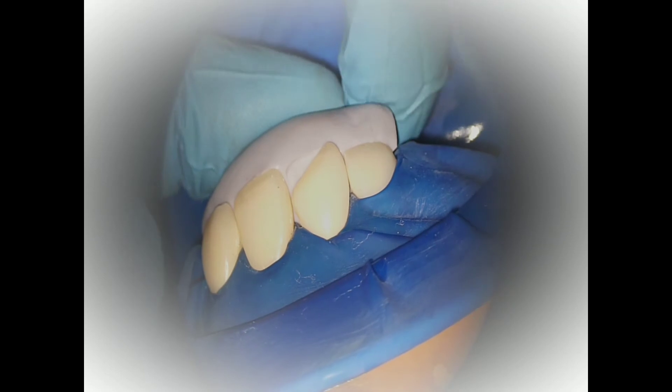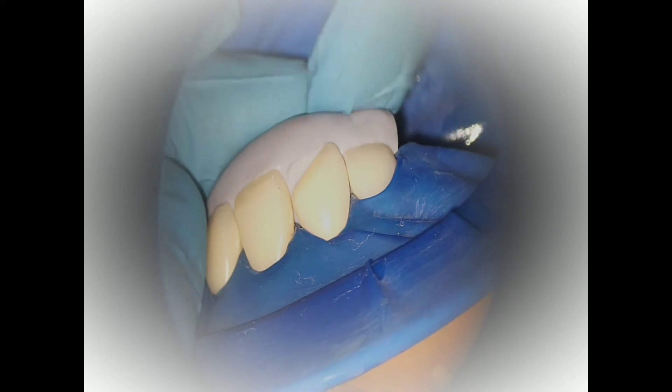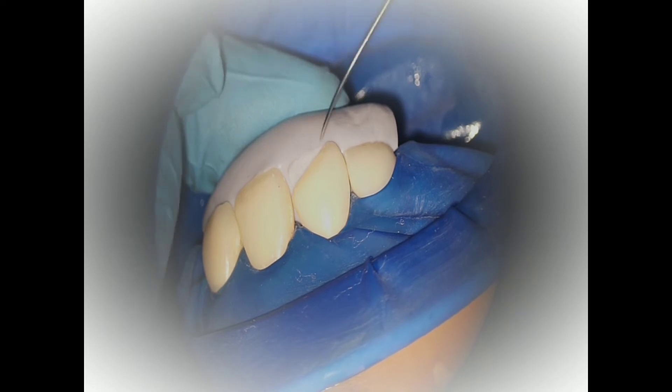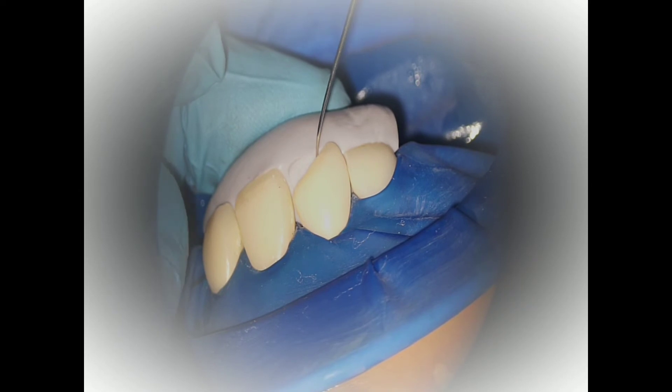We use the putti index to create the bevel. This putti index was made with the help of the wax up in the tooth. Now you can mark it with a sharp instrument — any probe, any sharp instrument — the margin.